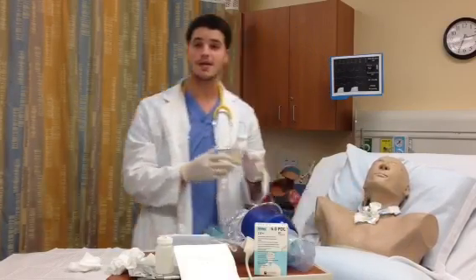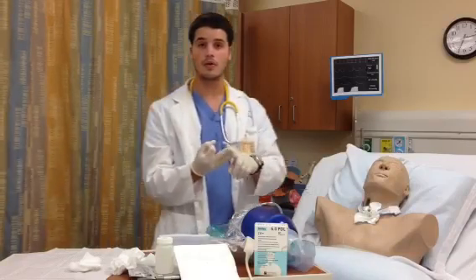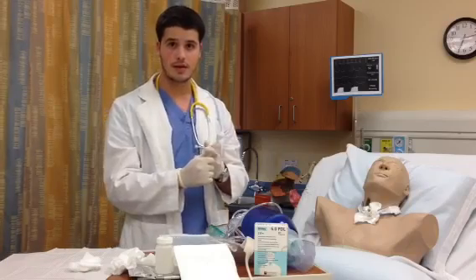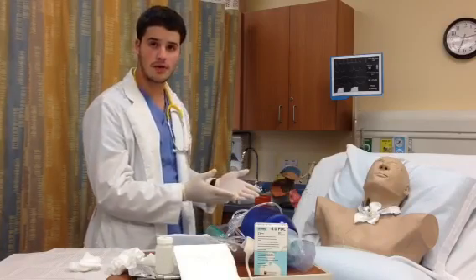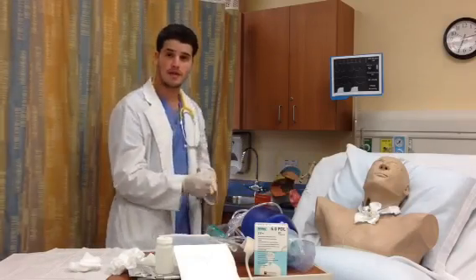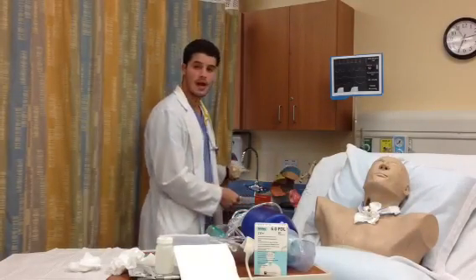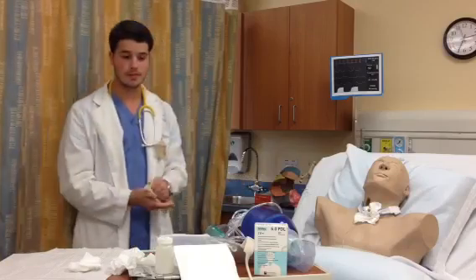I'm now going to reassess his vitals, heart rate, respiratory rate, pulse ox, and breath sounds. I'm going to chart everything I did. I'm going to ensure the patient comfort. I'm going to take off my gloves, then wash my hands and exit the room after I've cleaned up.